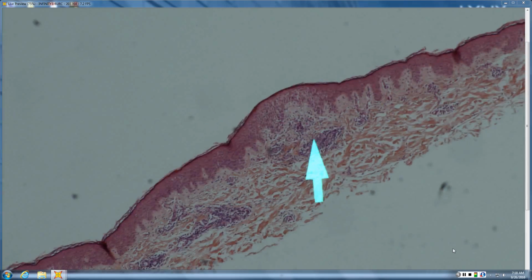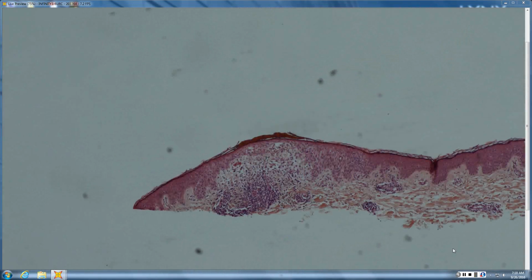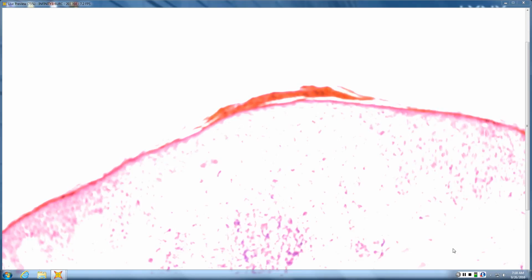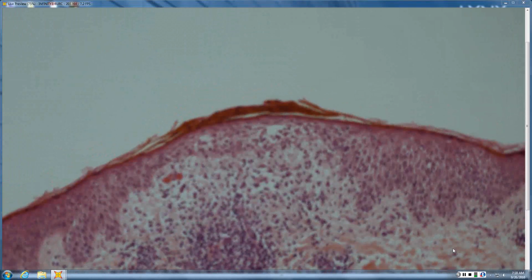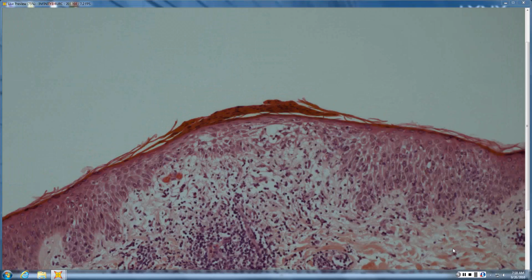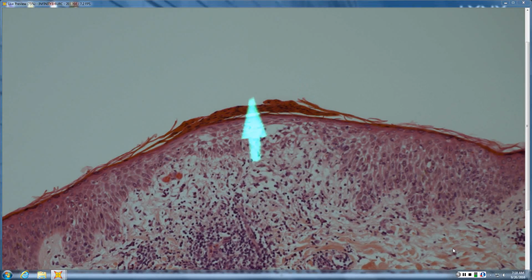Oh, that's right. This is another pityriasis rosea. I think this is the one that had the 45-degree angle thing a little bit better. So you can see here, you don't always see this, but you have to use your dermpath imagination skills. But basically, little focus of parakeratosis, no neutrophils. Maybe it even has the teapot sign if it was angled up for whatever reason.